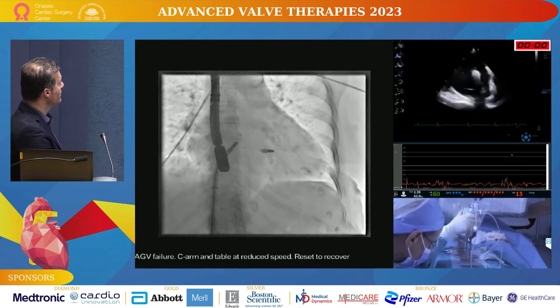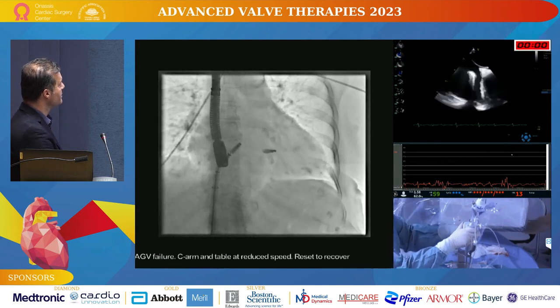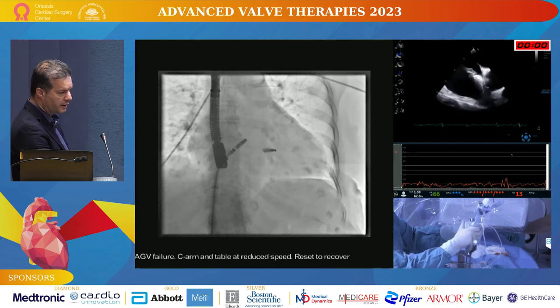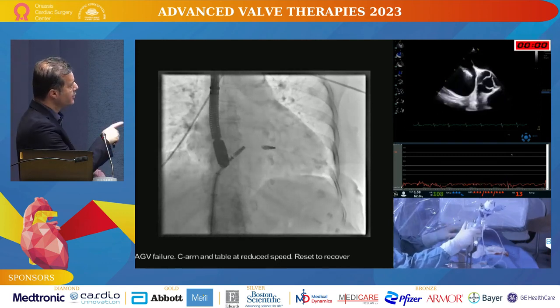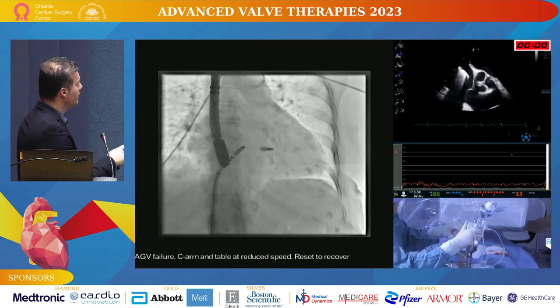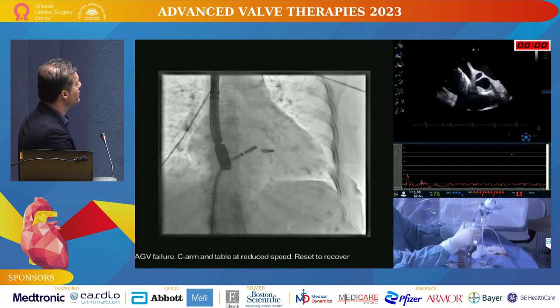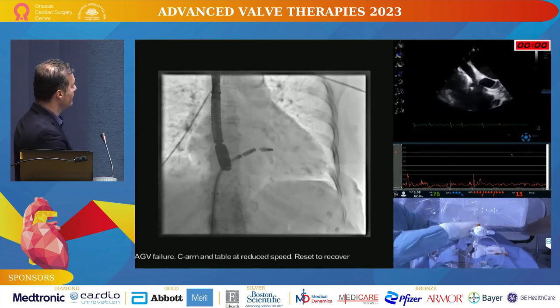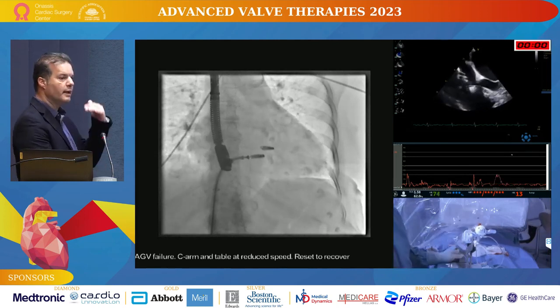Of course, now clip is out, and we're bending, we're flexing down towards the tricuspid valve. And usually this is a maneuver that on tricuspid it can be done within seconds. It's easier than the mitral because the excursion is shorter and there's usually more space in the right atrium, plus you have your clip now as a marker. So now we're bending down towards the tricuspid valve and the clip, and we can always use the configuration of the first clip to guide the second clip.